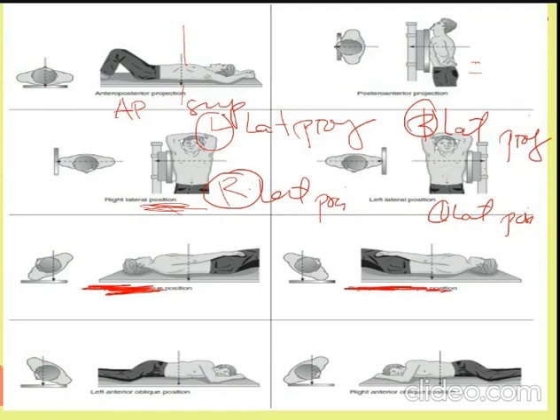Left posterior oblique. Good. So left posterior oblique position. How about a projection? Right posterior oblique.